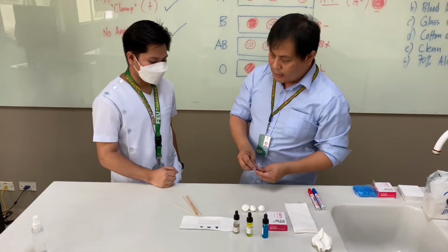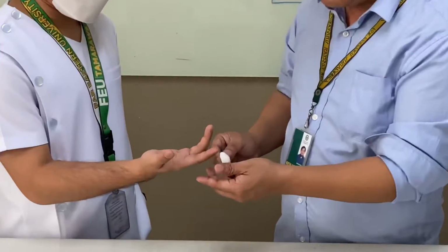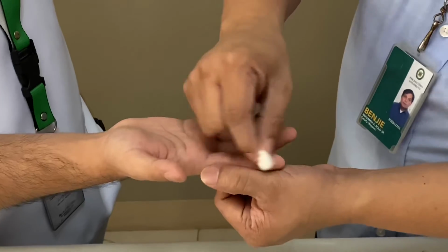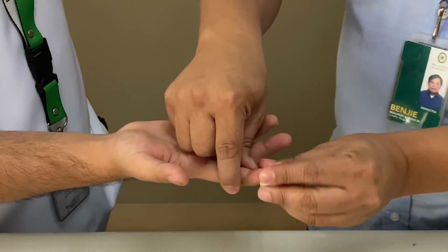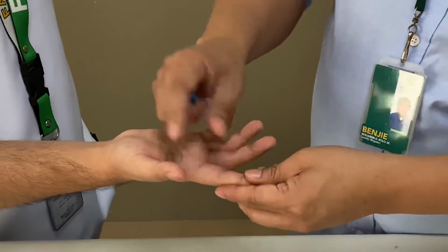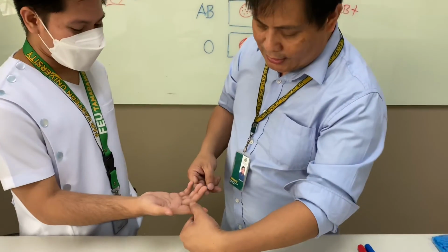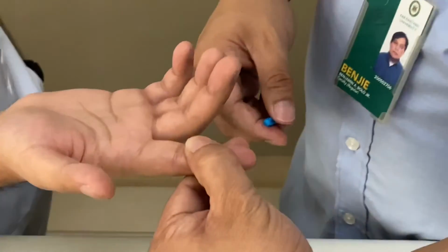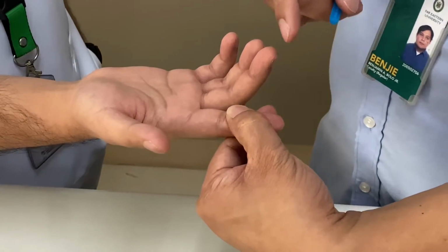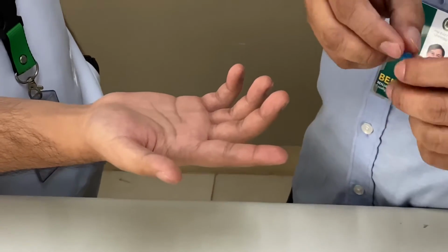Now, to start with the blood typing exercise, I will sterilize the fingertip of Von using 70% alcohol. Now, are you relaxed, Von? Yes, ma'am. Okay, I want to press his fingertip so it allows the blood to flow to the upper portion of his finger prior to pricking.